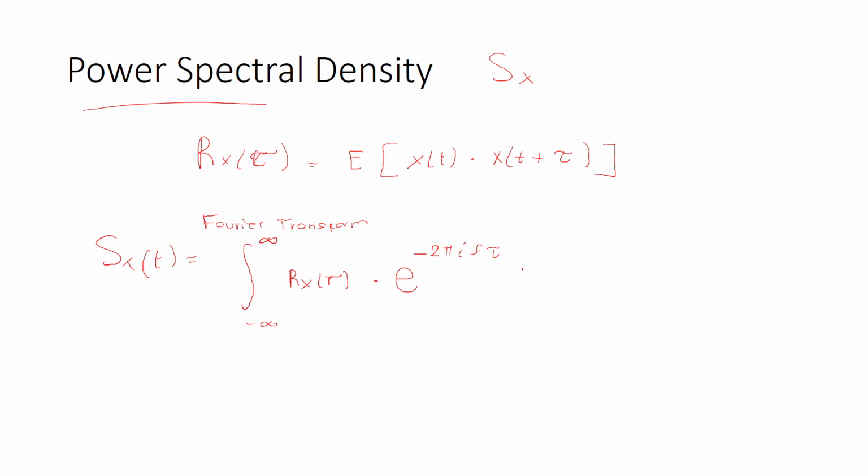This will give you the power spectrum of the signal.